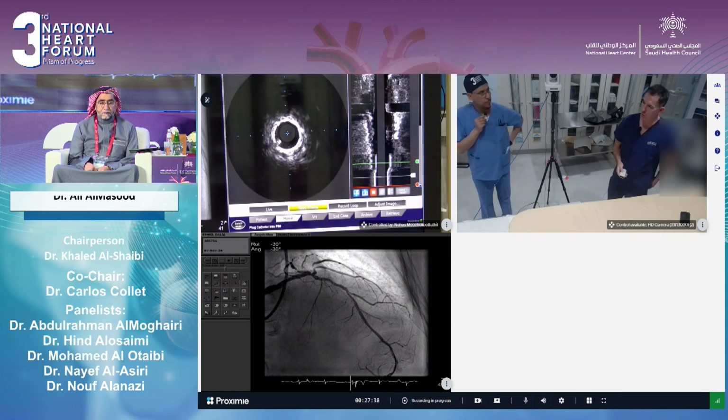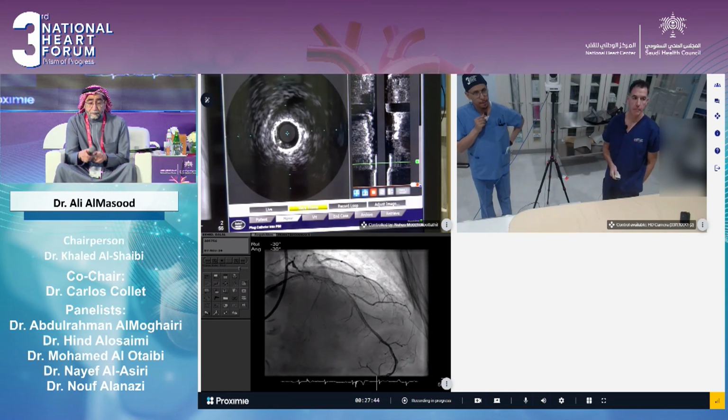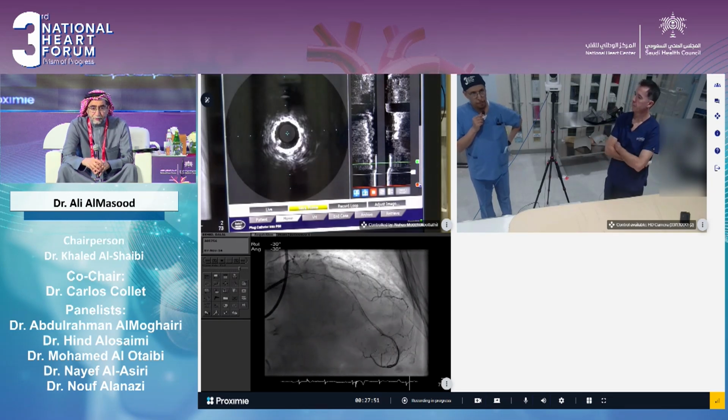Brilliant. Okay, good. And you've gone through the setup slides, Carlos, clinical history? Yes, we already discussed the clinical history. We saw the PCI of the right coronary and we showed the diagnostic pictures of the left. So please tell us what you have done after that.